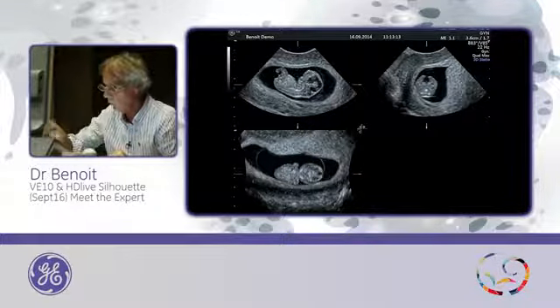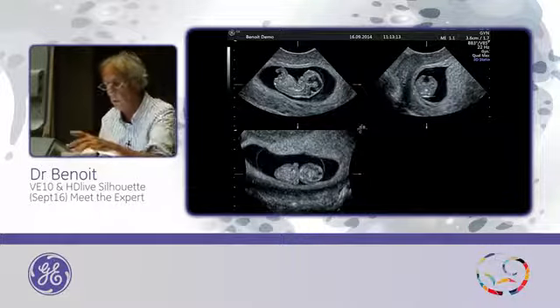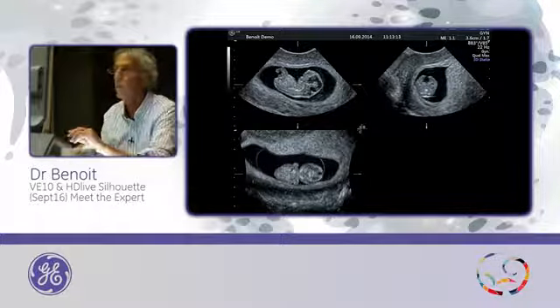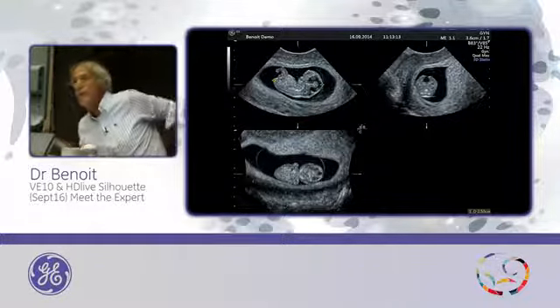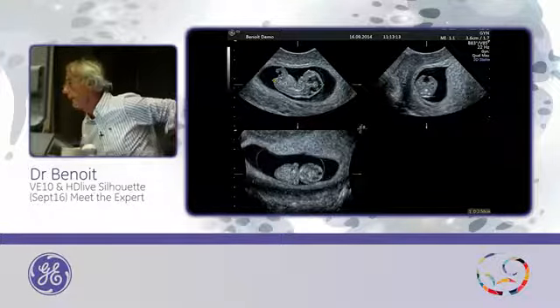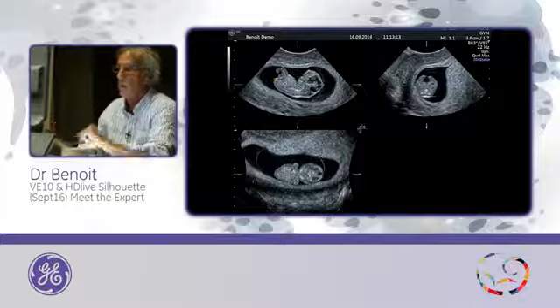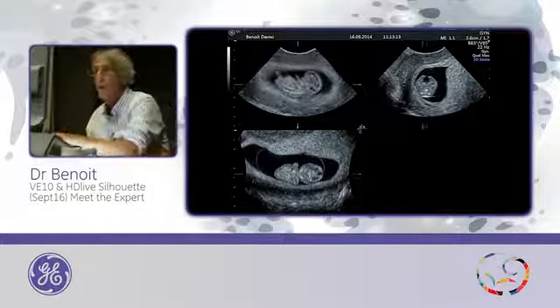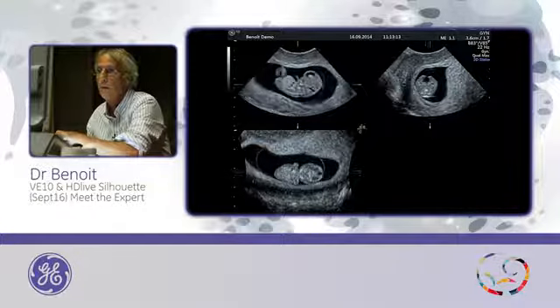And if we want to know it, the best is to do the measurement. So we will do it from here to here. It's 25 millimeters. That means it's 9 weeks and 2 or 3 days. This is a multiplanar view of this embryo with a brain vesicle inside.